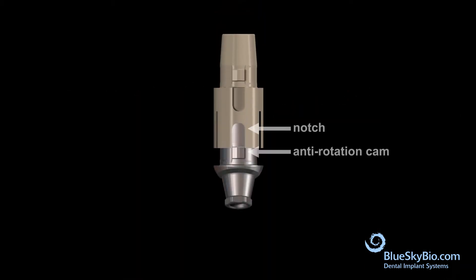Orient the notch of the Rosetta scan body adapter with the anti-rotation feature of the titanium base abutment and press together with firm finger pressure.